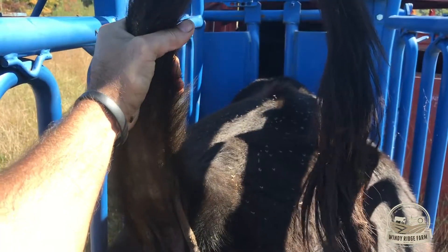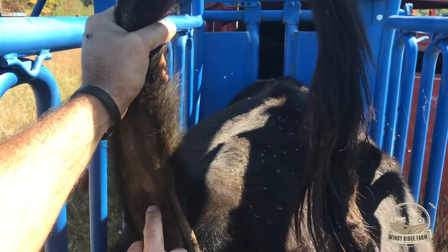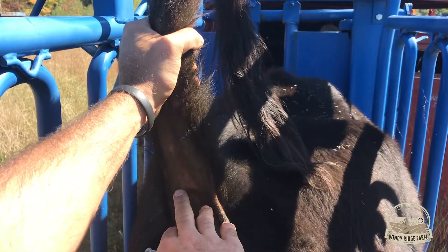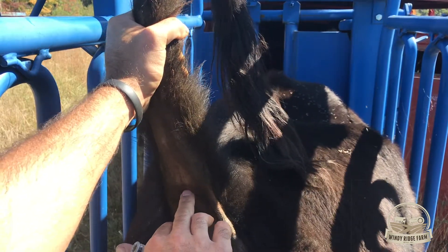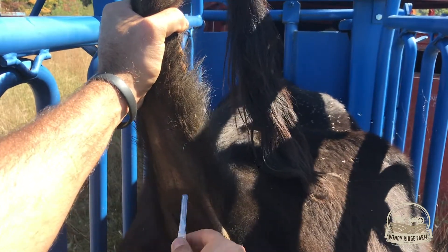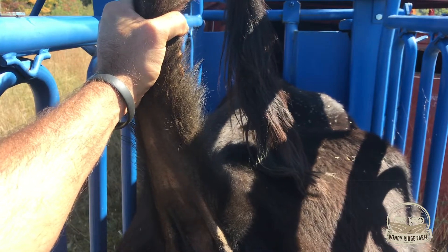So let me show you how to draw the blood. Lift the tail up and you'll see an indentation, then like bone, and right just below that bone dead center — you want to go straight in, not at an angle, just straight, and you should hit the artery.